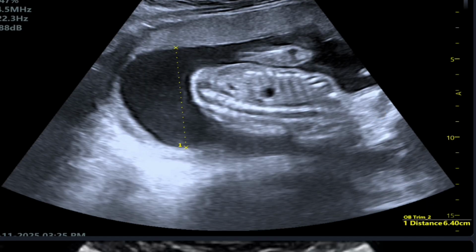Here also is a sonogram showing the measurement of the single deepest pocket. Also, in this sonogram, with the measurement taken, we see there is adequate amniotic fluid.